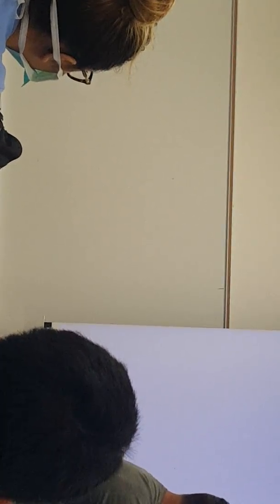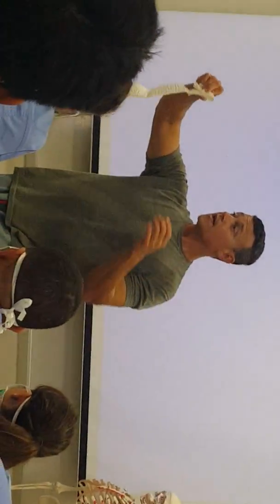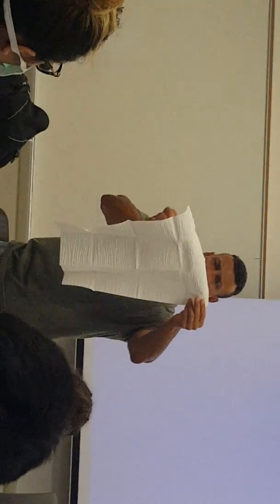Got it? So, now that I'm all drip dried, close to it, I'll reach over, grab my towel. I will divide this towel or open it up as big as it can. I think I showed you this before, right? Grab, and I start to dry one side. Again, this part being the cleanest.